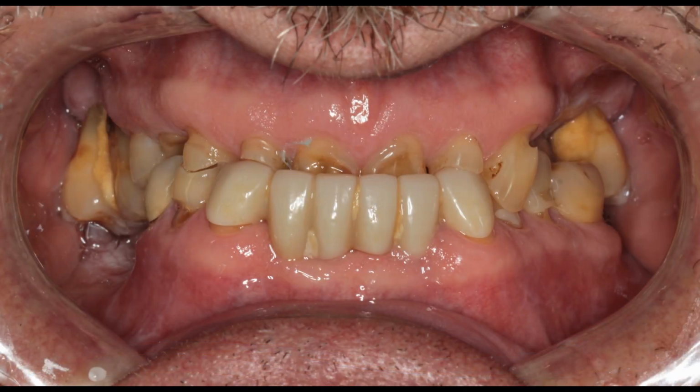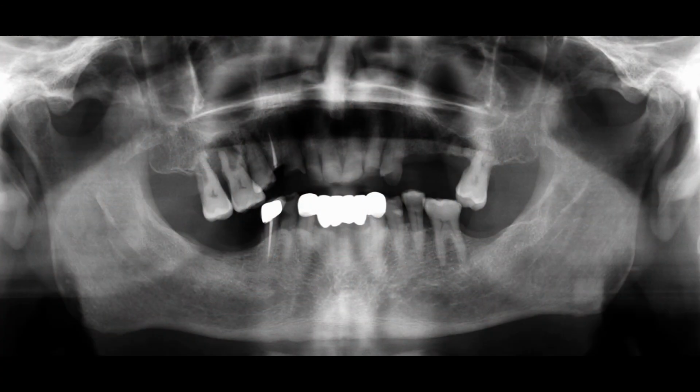This gentleman presented with what we call a class 3 deep bite, meaning he's got a bulldog bite where his lower teeth are in front of his upper teeth. This is his preoperative panoramic image, and what I'm always looking for on the initial images is how much bone persists, how much bone is still present to allow us to do non-bone removal implant treatment.